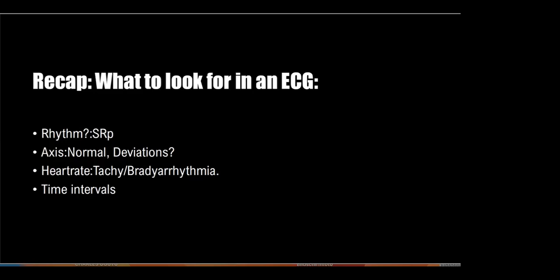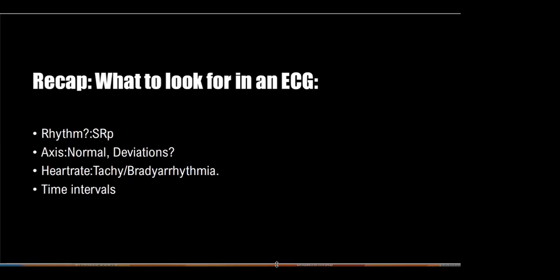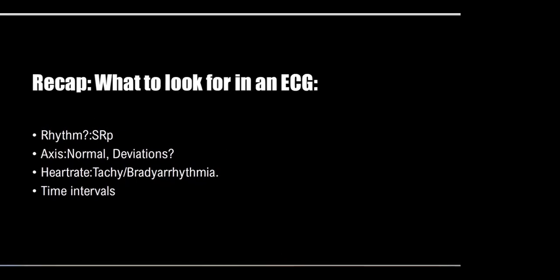If you listened keenly last time, I believe we discussed the intervals. Above 100 beats per minute, we call it tachycardia, and below 50 heartbeats per minute, we call it bradycardia.